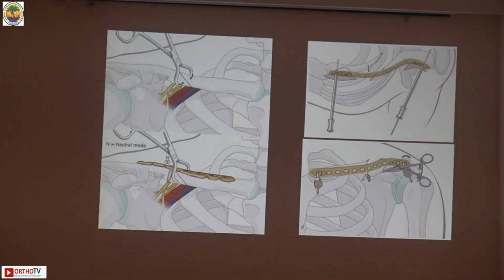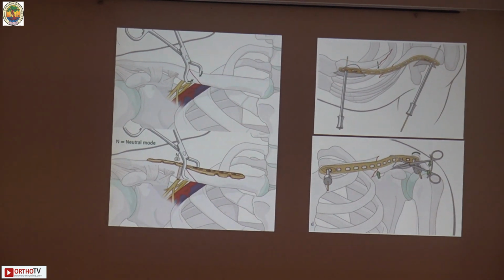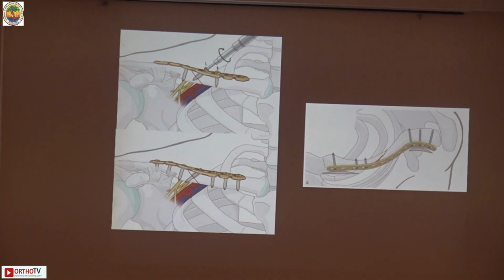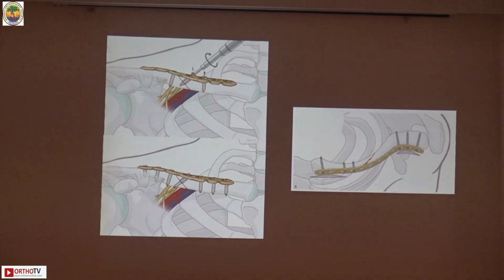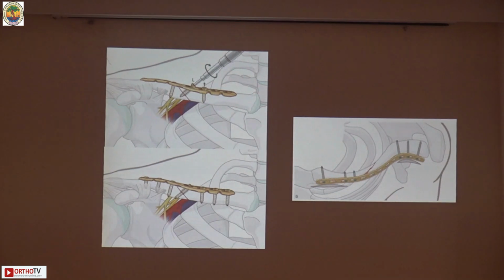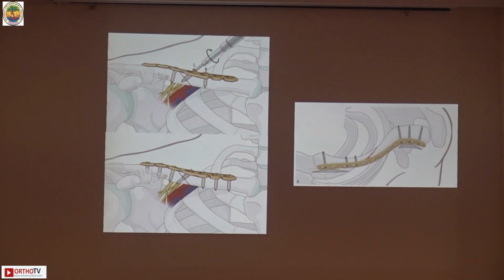Hold the fragments with pointed clamps to minimize soft tissue trauma. The plate can be held to bone with a sleeve, K-wire, or maybe with pointed clamps. Using a lag screw, either independently or through the plate, we proceed with fixation of 3 screws on either side of the fracture, but in a heavy patient we must use 4 screws on either side.